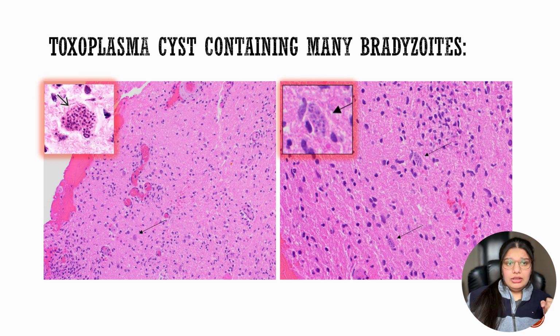Moving on, the toxoplasma cyst. This is a slide of the case, and what we see here are cysts of toxoplasma containing toxoplasma bradyzoids within. This is the higher power version, showing the whole encysted area with these small organisms in it. This is another clearer picture of a cyst with a bag of bradyzoids, at low power, high power, and then further high power. This is an important finding when we suspect toxoplasmosis.